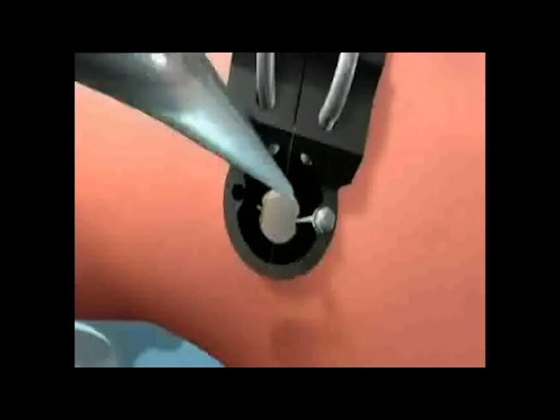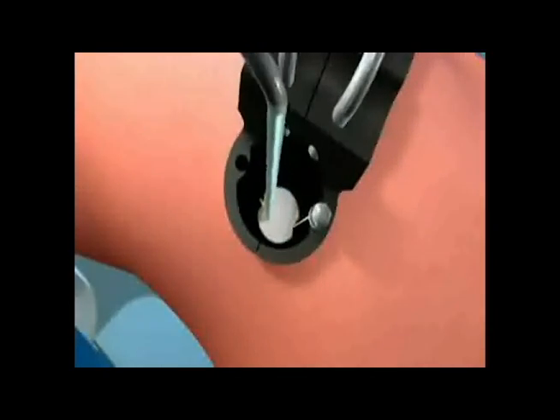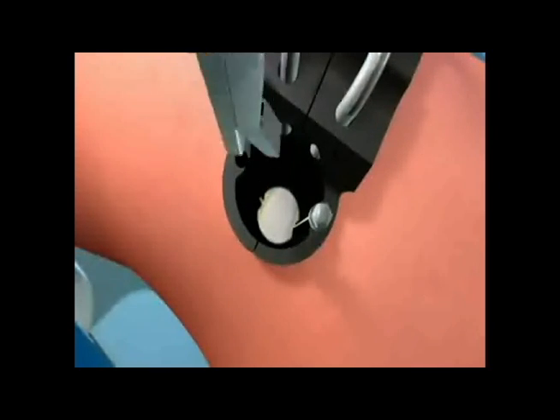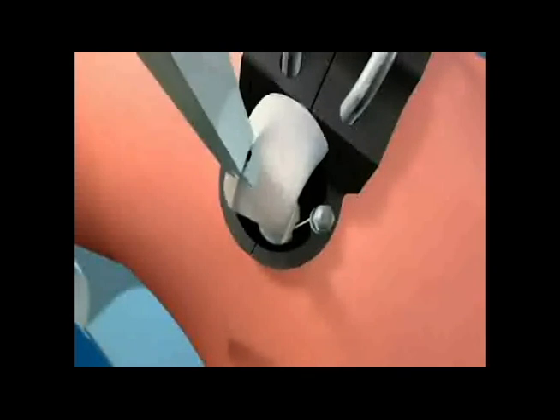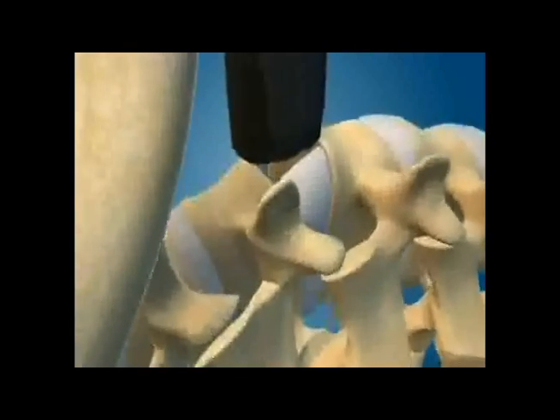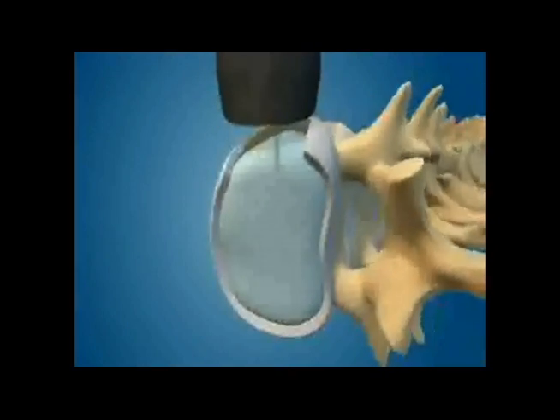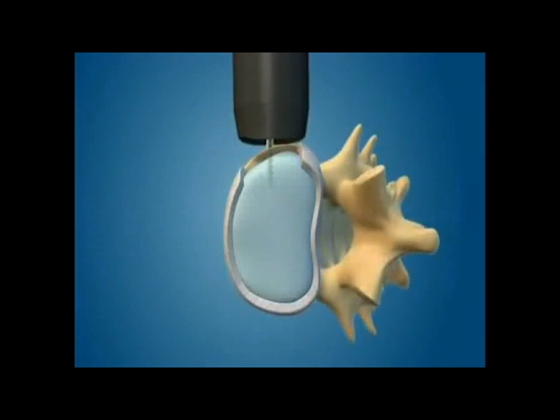A light source is added to give excellent visualization of the spine. An opening is made in the disc and the disc material is removed. As the material is removed, the opening is enlarged to allow for the rest of the disc material to be removed and the endplates of the vertebrae to be prepared for the fusion.